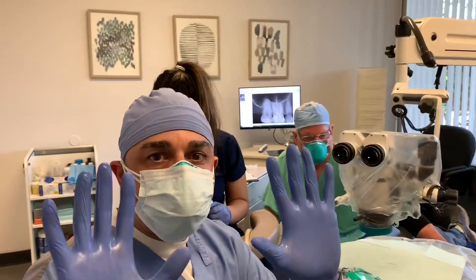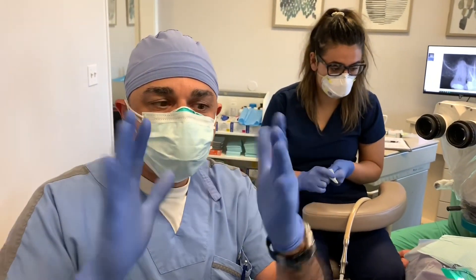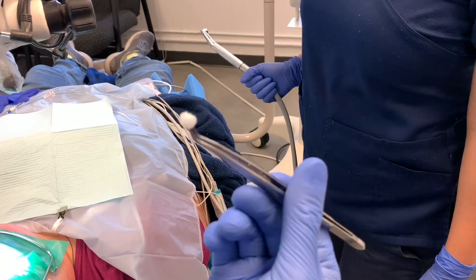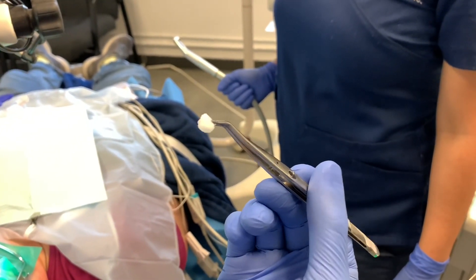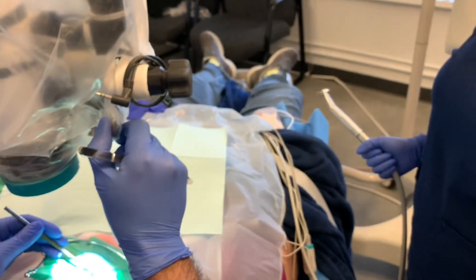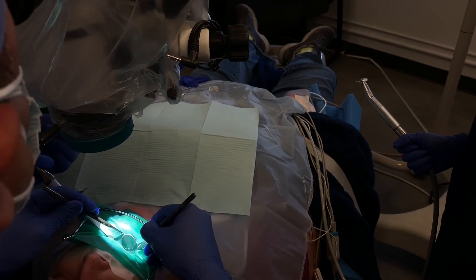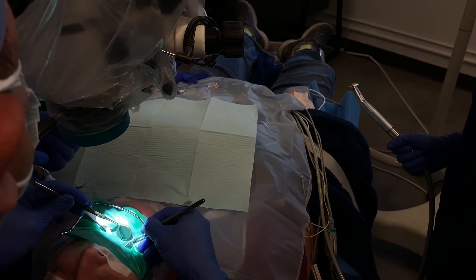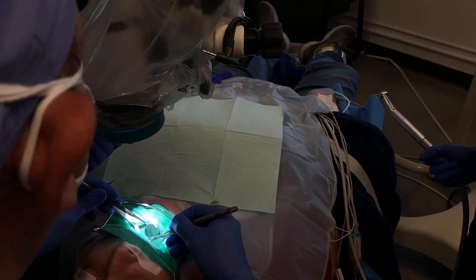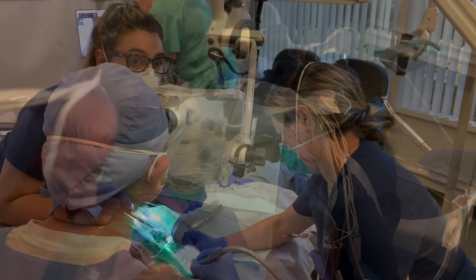We use hand sanitizer with our gloves. The next thing we do is use 70% isopropyl alcohol to sterilize the tooth, rubber dam clamp, and rubber dam — rubbing against all the surfaces to make sure everything is sterilized, nice and clean.